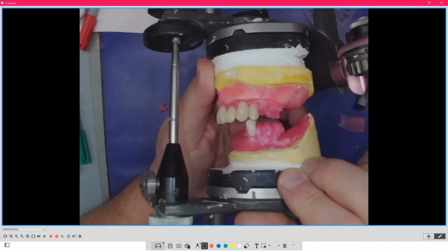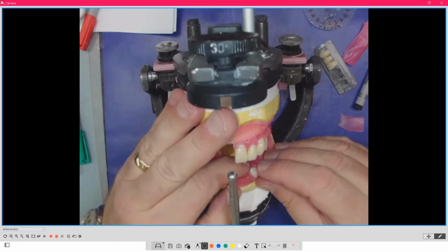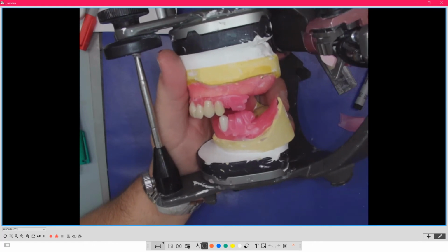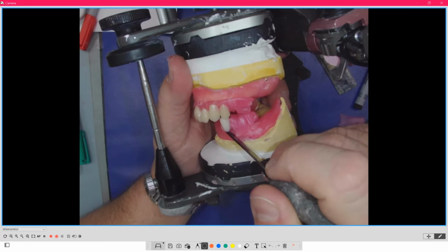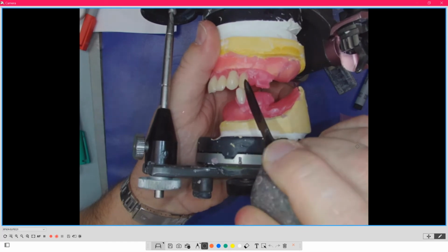Now here's some of the subtleties of this. If I set that first bicuspid in what we would deem as proper occlusion, proper meaning cusp to fossa occlusion, this is what we would want to see. I would want to see that tooth properly interdigitating against the upper.